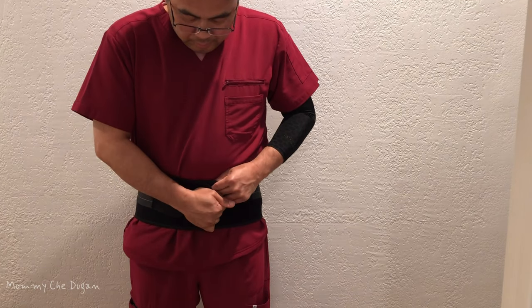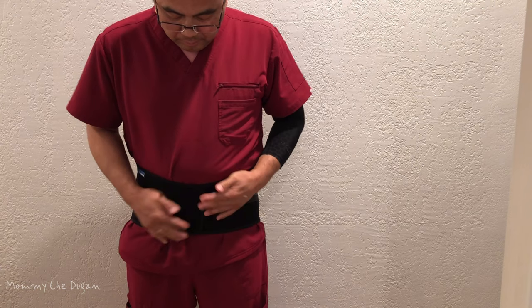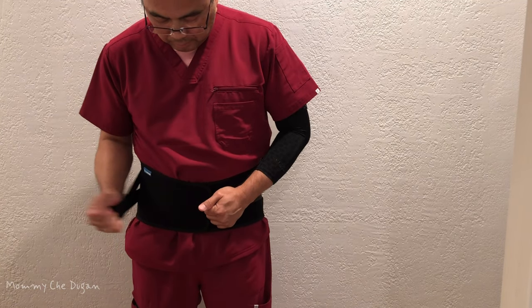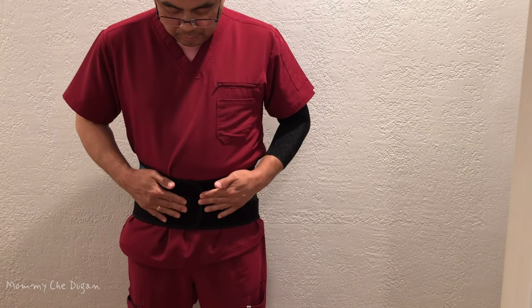The shaped memory aluminum splints automatically conform to any body shape for a natural fit, and it is adjustable, allowing you to customize the fit for maximum effectiveness.